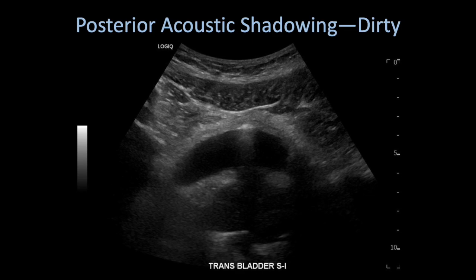We're going to look at an artifact called posterior acoustic shadowing, and specifically dirty posterior acoustic shadowing. In this case here, you can see air trapped within the bladder that is creating posterior acoustic shadowing, but there's some increased echogenicity behind it, so this is referred to as dirty posterior acoustic shadowing.